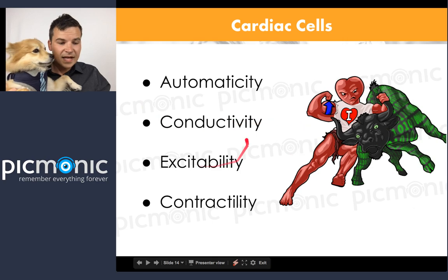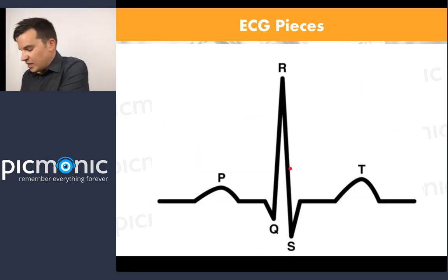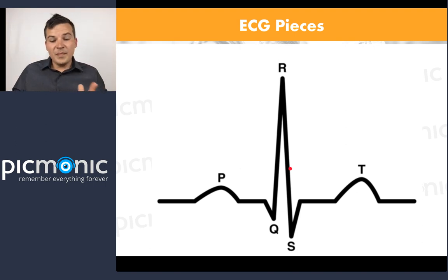They excite themselves as well as they are contractile. Now that's a bunch of basic stuff. Let's talk about ECGs themselves. When we talk about the ECG, you've got to know the parts. I mean, if you don't know, it's like reading the user manual. You have to know the basics before you can really dive in. Otherwise, you're destined to fail. So let's talk about this.